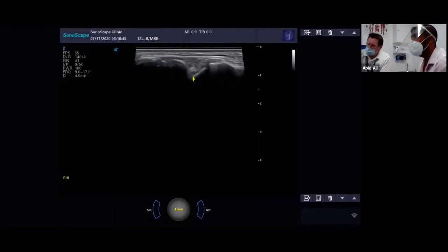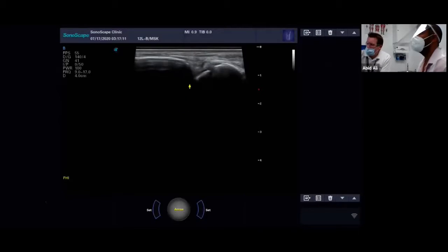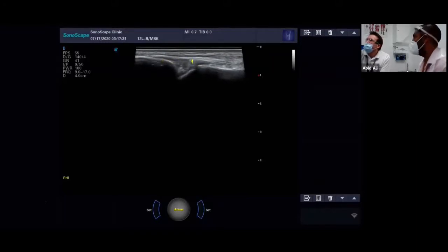If you want to freeze that image for me there, please. So you can see in the joint here, it looks quite clean lines inside the joint. There's no osteophytes, there's no calcific deposits, there's no effusion sitting in there. It looks quite nice and round and healthy. The two ends of bone are coming together. And you can just see a bit of ligament over the top of it as well. That little white hyperechoic line is the dorsal talonavicular ligament.